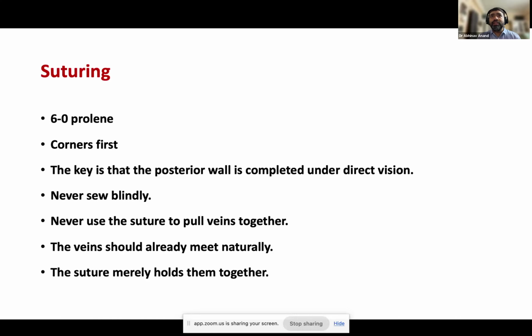If it is so extensive that the lumen is compromised, or the caliber is very low, or there are chances of thrombosis, or it is not suitable for the shunt, then I'll ask the senior and check for another shunt, or we may abandon the shunt depending on the extent of the disease.